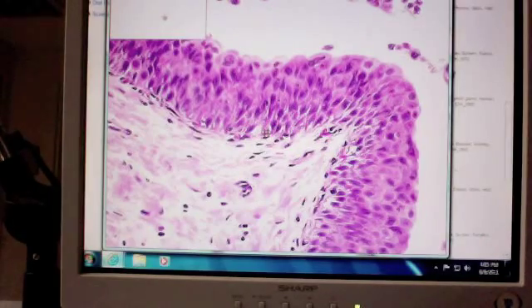All right, so if I put a double-headed arrow going from here to the surface and I said name this epithelium, transitional epithelium, and you should be comfortable with transitional epithelium because we're seeing these nice puffy little cells up on the surface here, and you can see all the way to the surface these cells are almost cuboidal in shape, okay? And for our other stratified epithelium that we had, they were squamous cells up at the surface. So both of those features should key you in that this is transitional epithelium.